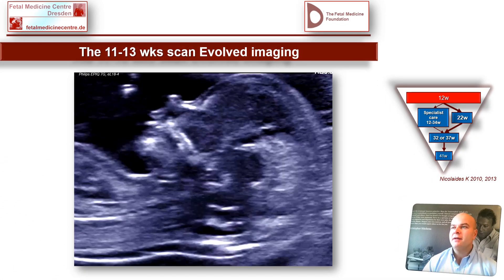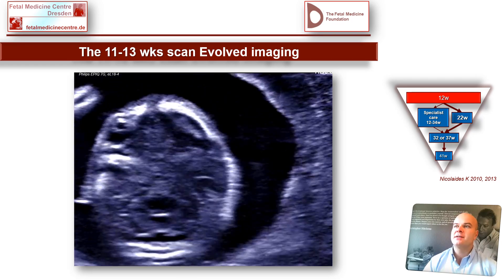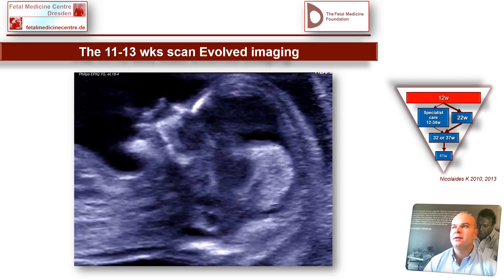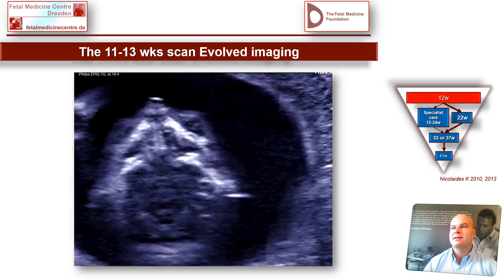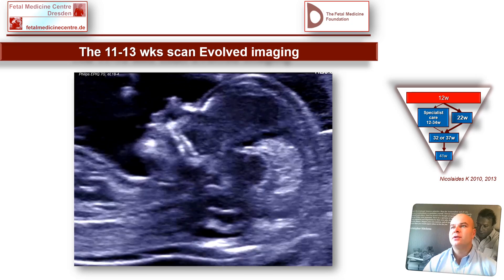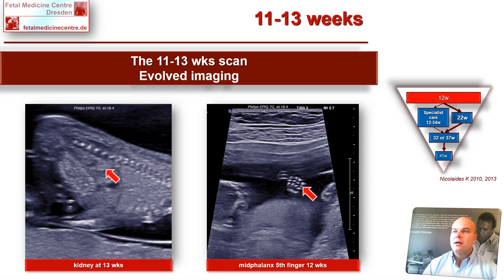The reason we are now better is we have much better machines. If you look at this fetus at 12 weeks, you can see the lip and the palate with an EL18-4 transabdominal scan. The need, especially for male gynecologists, of having a vaginal scan for screening for fetal abnormalities is reducing. With evolved imaging you can see the kidneys and the midphalanx of the fifth finger at 12 weeks. However, we should be really careful about counseling about such findings as the midphalanx of the fifth finger at 12 weeks.